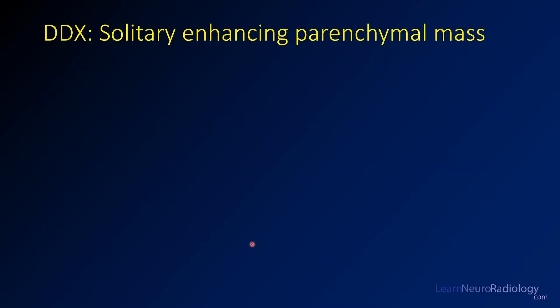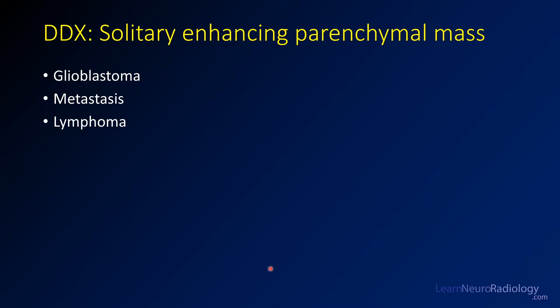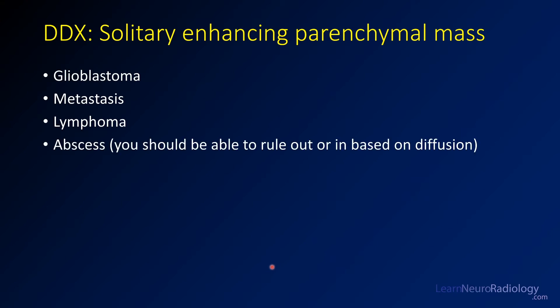This is a solitary enhancing parenchymal mass. In this case, you have a solitary nodule in the right frontal-parietal region or posterior frontal lobe. When you have that, you need to think about a specific differential diagnosis. You want to include GBM — glioblastoma is probably going to be one of your first thoughts, particularly in an older patient. Metastatic disease is definitely a major consideration. Lymphoma, while it's more typical to have multifocal disease or involvement of the subependymal surfaces and basal ganglia, can definitely present with a single solitary nodule.